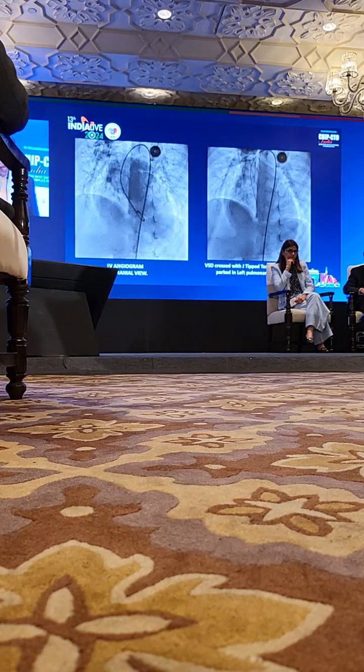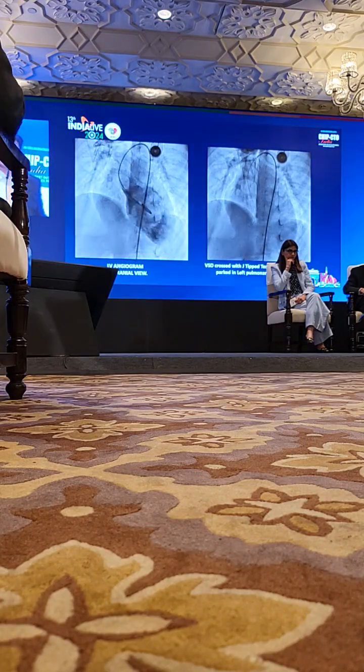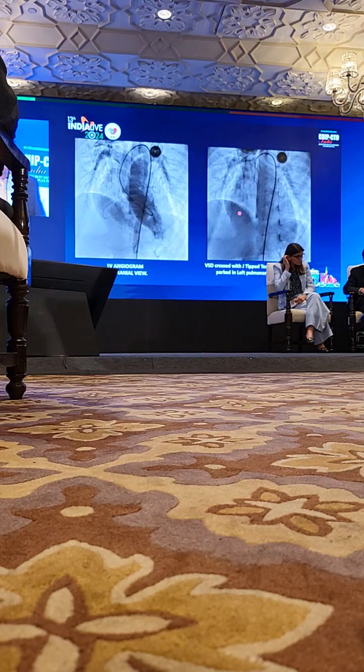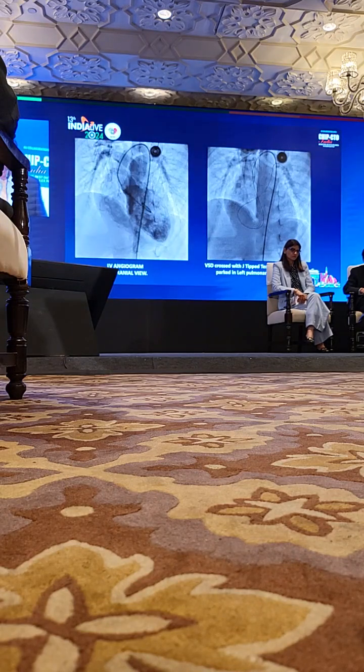This is an LV angiogram in LAO cranial view. Not the best or the most favorable VSD, I should say, but in the 50 plus cases I have done in the past, so many times we have still got away with device closure in such kind of VSDs. So in the right sided image, we can see how we are able to cross the VSD through a J-tipped terumo wire, and once it crosses, it has to be parked either in the pulmonary artery or in the SVC or in the IVC if we are lucky. So here we can see that it's parked in the left pulmonary artery.